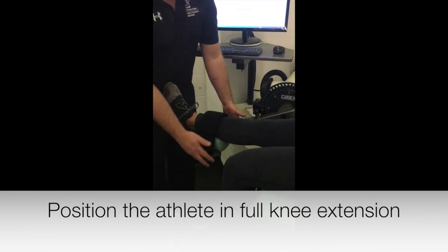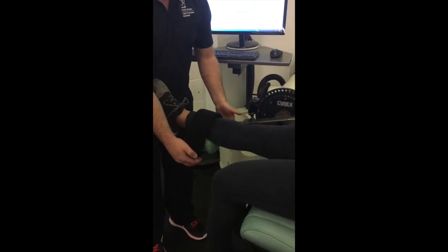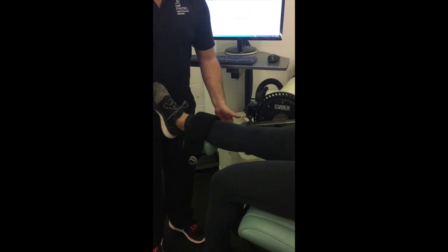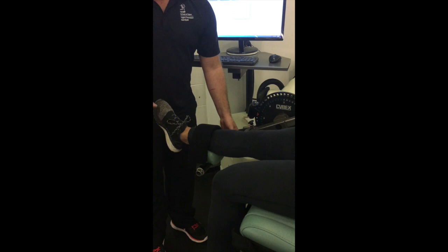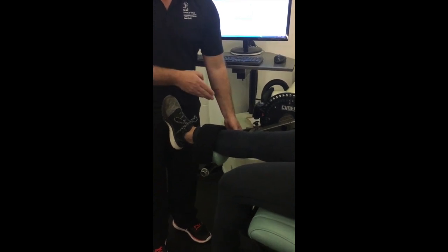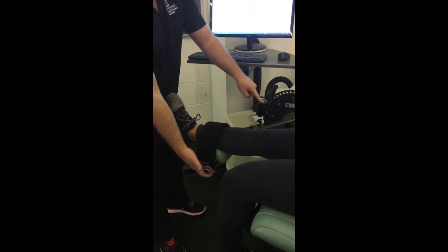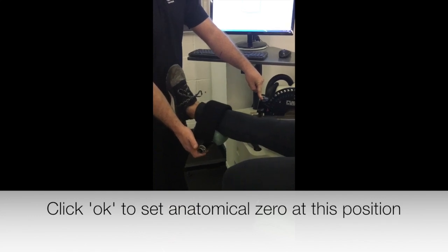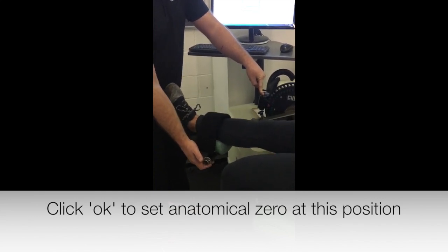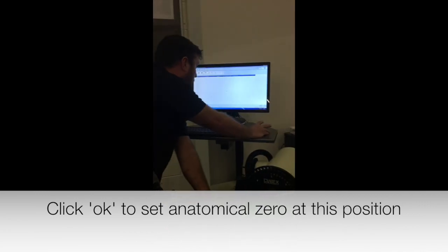Fair? So what I will allow you to do is just move that stop to, take it to full extension, so hamstrings are starting to kick in there, and then come back a bit. All right? Or if you're more comfortable with the safety, just stop it where that stop is. But I don't mind if you only move it 1 or 2 places, because it's still then safe. Because that's still going to be the limit of extension there. It's not going to do any harm really. But then come back a little bit, come off there. Click. Okay, and that's now set up for 0.